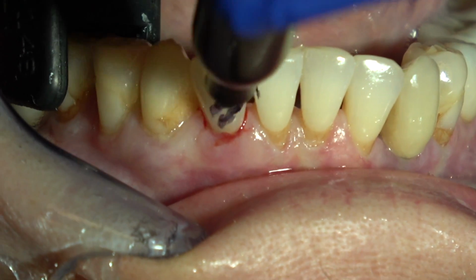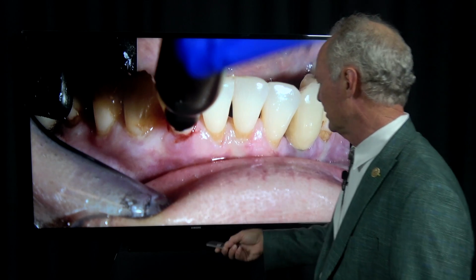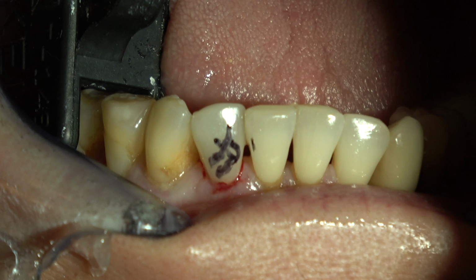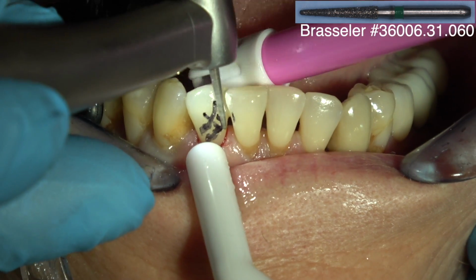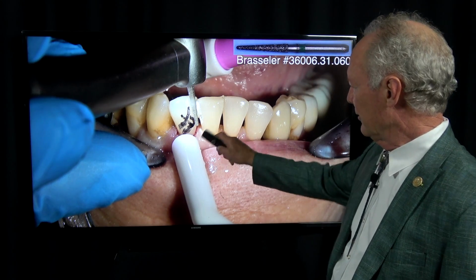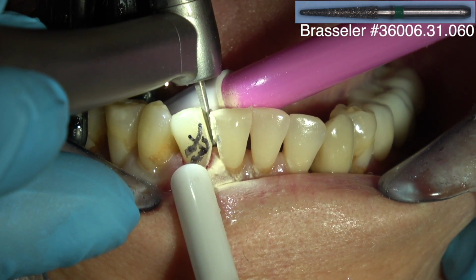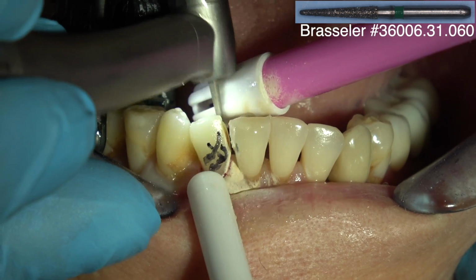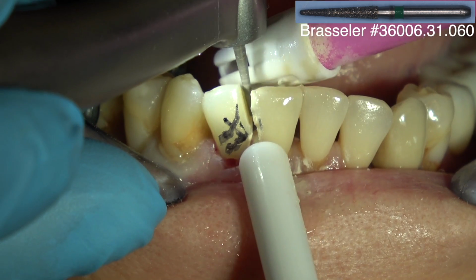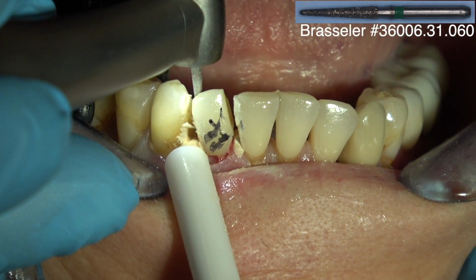Anytime I'm extracting a tooth for orthodontic purposes or a tooth like this, I always mark the tooth. I know which tooth it is, but I don't want to have to think about that, so I mark it just to be sure. Now, this is a hot tip. I'd like to elevate the tooth mesial and distal before I extract it, just to loosen it up in the periodontal ligament. So if you've got tight contact on both sides of the tooth, you don't have any space to elevate it into, and so you really can't elevate it.